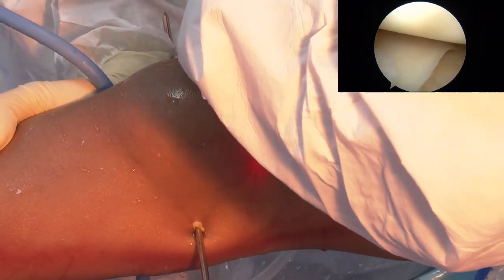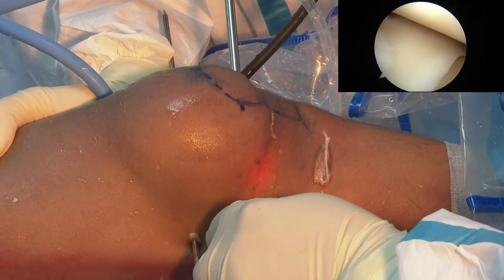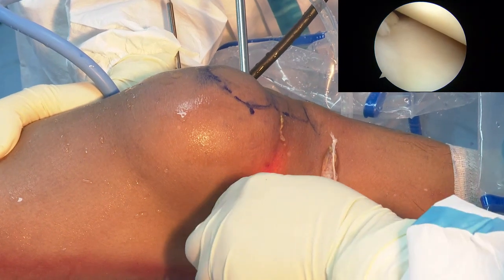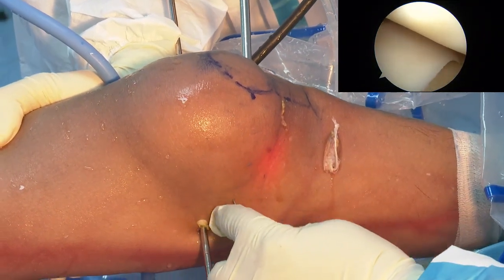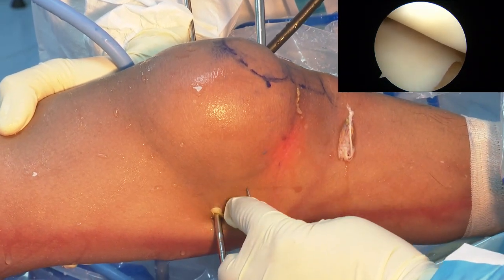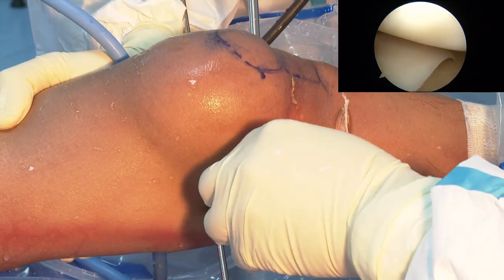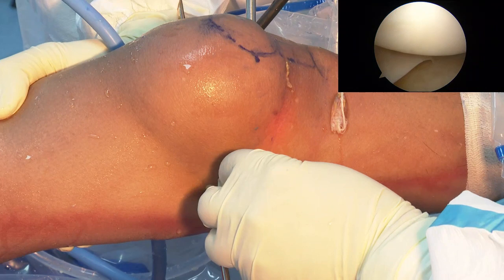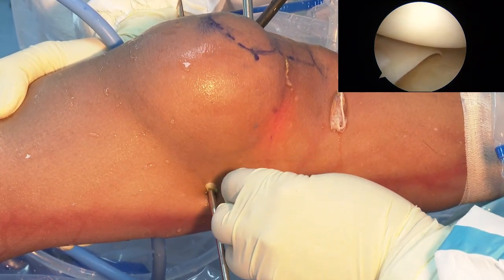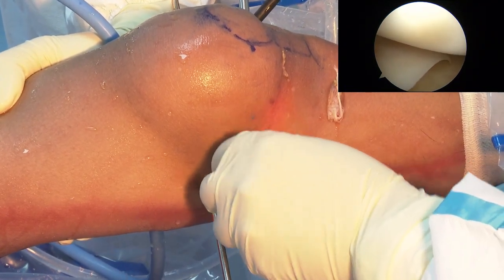那我们要对 MCL 做松解，多点穿刺松解呢，这个穿刺点呢是在关节线1.2公分的地方，是位于内收肌结节的延长线和关节线的交界处。But actually, we need the 18 gauge needle. 一般呢，这个穿刺针最好选个18号的针头。And then you do the touch. If you touch to the right point, the joint will open immediately. Okay.